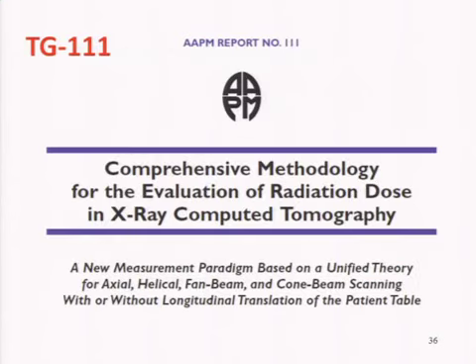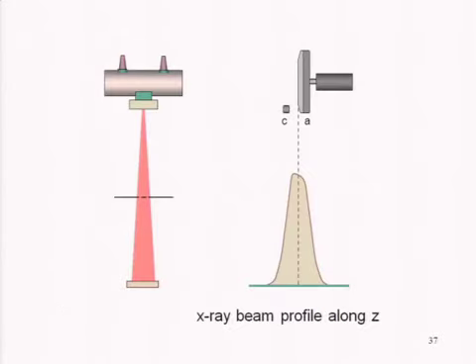And this is very much related to TG111, which was chaired by Bob Dixon and came out last year. Many of us were on this, not without its controversies. So let's go through some of TG111 and what it teaches. And really what it teaches is to start with the beam profile, as I try to show you here. So this is the beam, if you were to measure it.